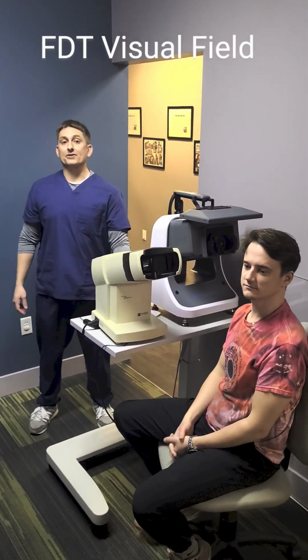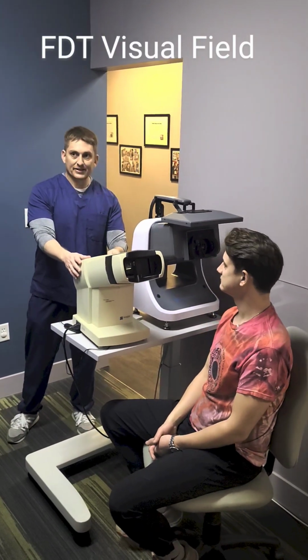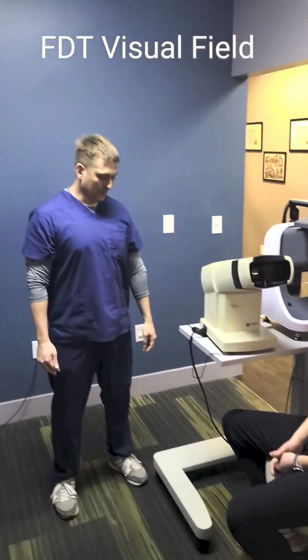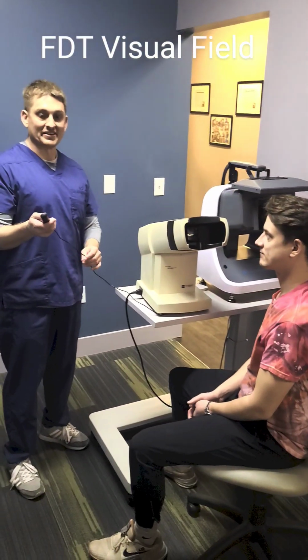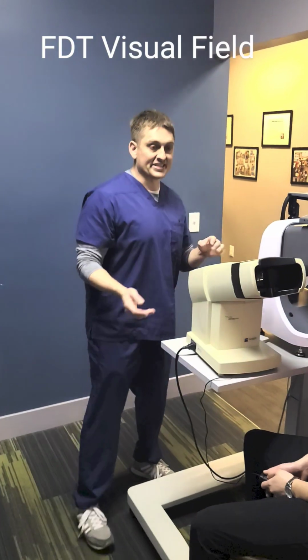Okay, I'm going to show you how to use the FDT visual field measuring instrument. So first of all, make sure the patient is seated comfortably and upright, preferably both feet on the floor. Have them turn and face the machine. Hand the patient the stimulus button and show them that they can click that button. All right, so they'll click that in response to seeing the stimulus.